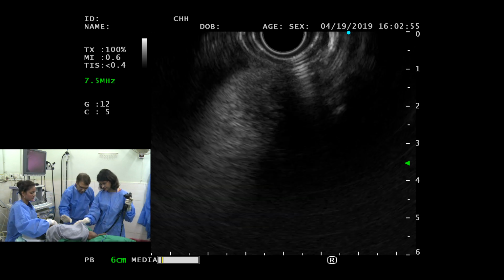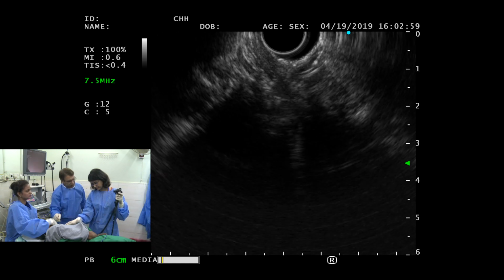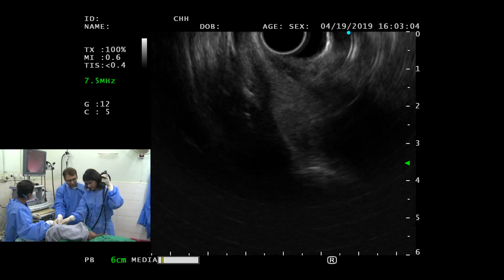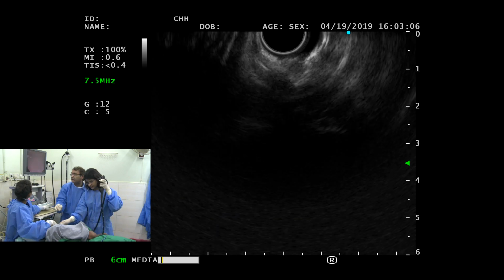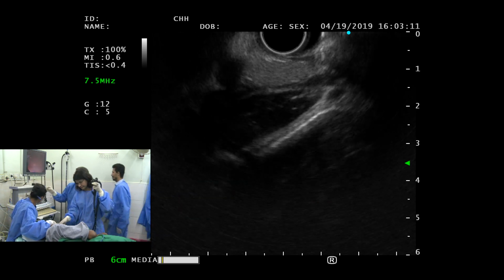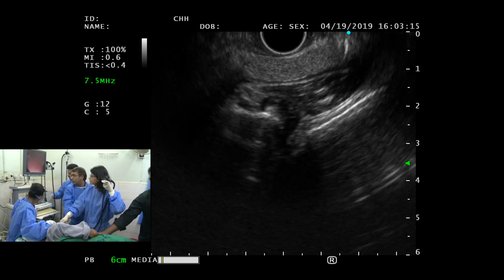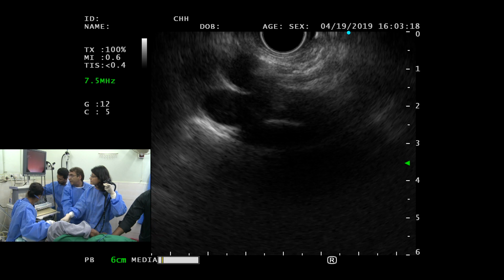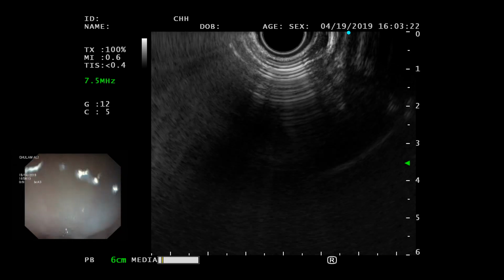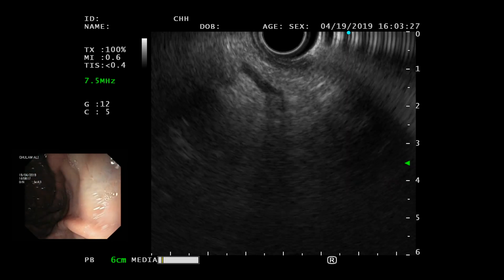So you go in above the tongue, it will hit the back of the throat, and when that does, then you gently, very gently move and then gently rotate, okay? And you can see that here on the endoscopic view. When you get to the back, what I do is a gentle rotate. If you rotate it like that, it will go through, okay? They usually end up swallowing it. So very gentle, very gentle. When you go through the esophagus, you have to slow down.